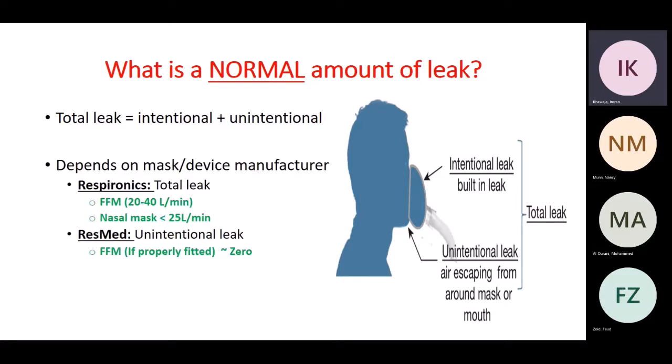So the answer for this depends on the device, on the mask type and the device manufacturer, okay? So when you get the download data, let's say that we're using a Philips Respironics, whatever is applicable for CPAP and BiPAP is applicable for the AVAPS and Trilogy as well.